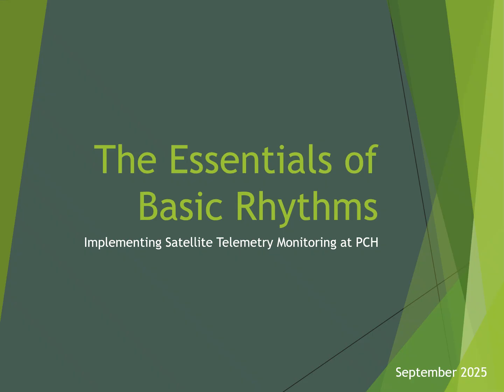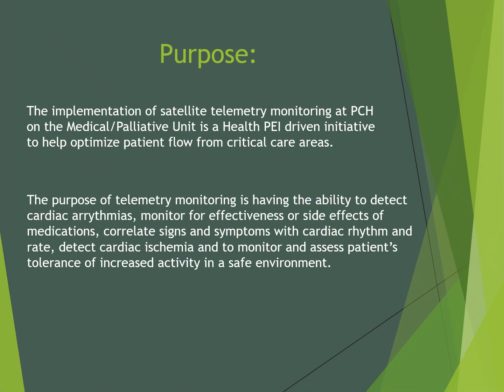This presentation will review the essentials of basic rhythms as we implement satellite telemetry monitoring at PCH. The implementation of satellite telemetry monitoring at PCH on the Medical Palliative Unit is a Health PEI-driven initiative to help optimize patient flow from critical care areas.